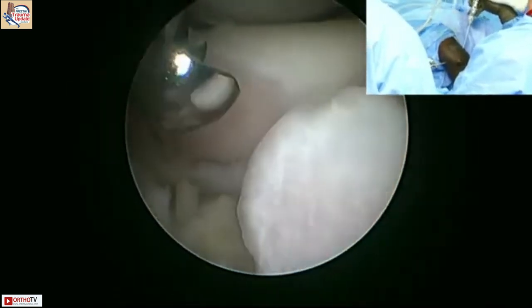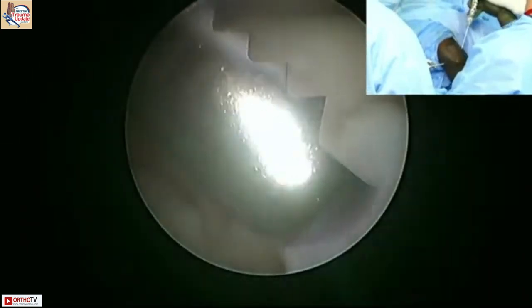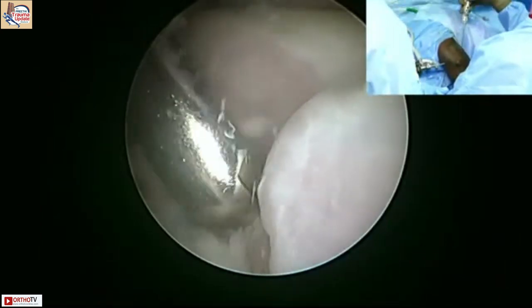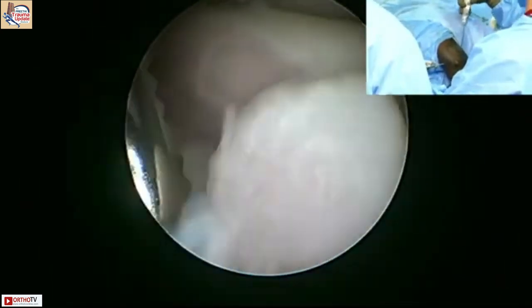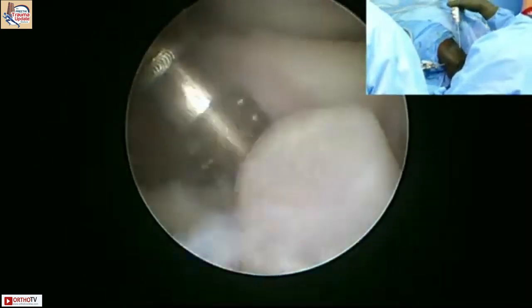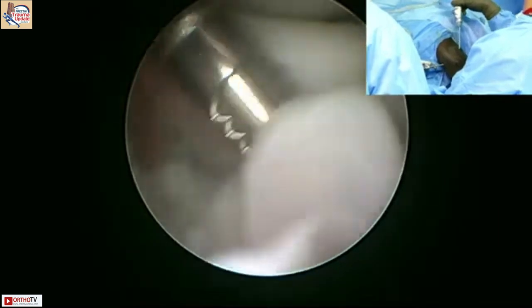Okay. So this is easy. So this is a very useful tip. You can take the suction off, and then you will see the joint will not collapse, because all you want is taking the bottom of the loose body off.